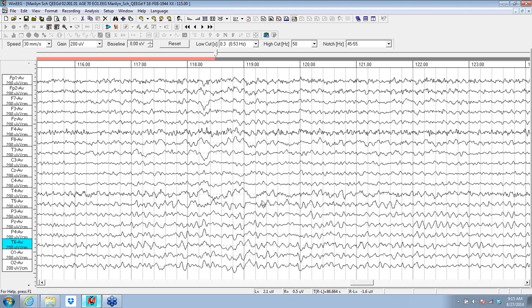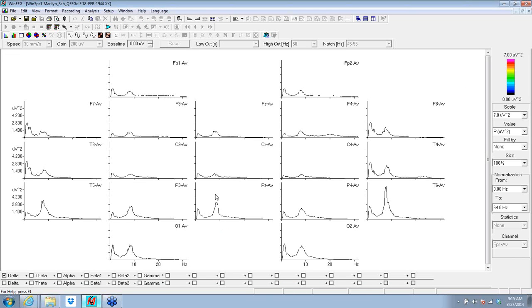Run this full EEG file through a Fourier. And at this point, we see this is the background alpha peak, and the frequency is going to pop up here, and the amplitude will be popping up here, so you can see them numerically. This is an 8.5 hertz peak, but the range of alpha drops all the way down to the 7 hertz range before it disappears. And it really doesn't have any content in the alpha band at 10 and above. So the range of alpha going from essentially 7 to 10 is a slightly slow range, even though the peak is acceptable for age 70.